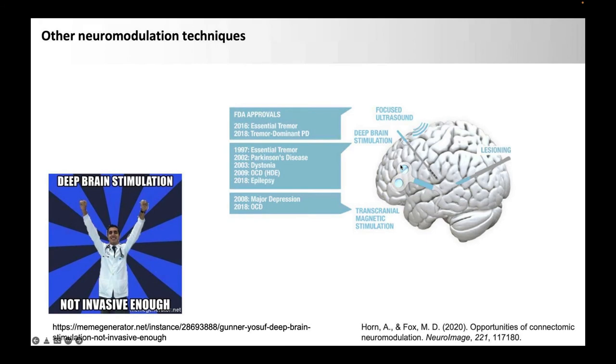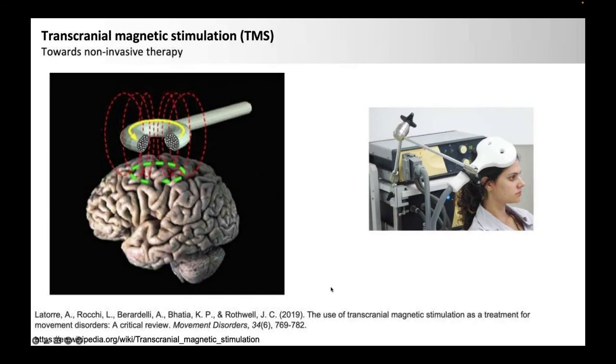All right. So we talked a little bit about how we could improve this in the future, taking into account more the higher resolution around the electrode, placing the electrode more precisely, activating only the fibers that are really activated, so making things around the electrode more precise, and also from the medical point of view of this adaptive DBS, that we can control for it. And another thing, the last point I want to talk to you about, is how can we do it for other neuromodulation therapies? Because there's so much more out there.